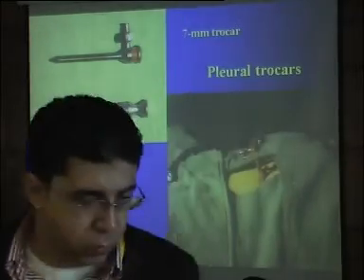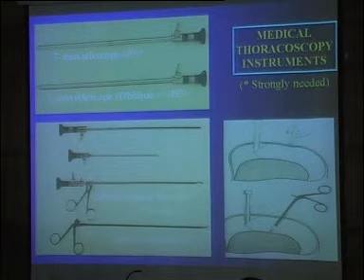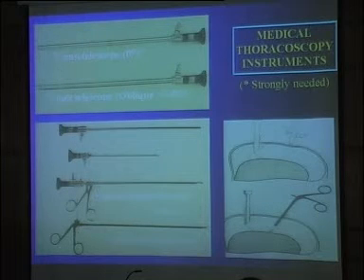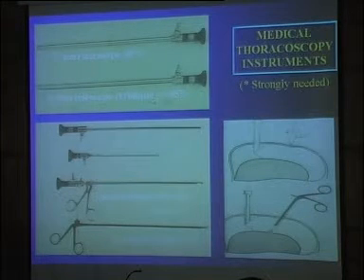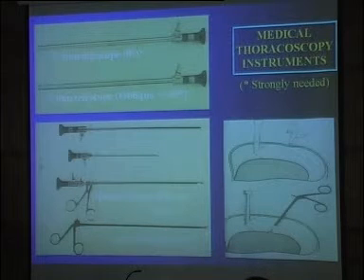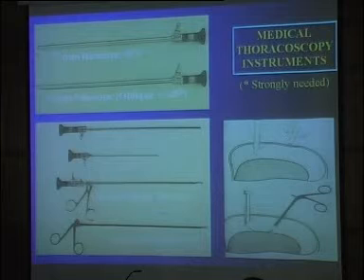And as you can see here, the trocar is in place, and you can start your procedure using such a telescope. It's a 7 millimeter telescope, as you can see here, with 0 degree angle, and a 7 millimeter telescope with an oblique angle of around 45 degrees.